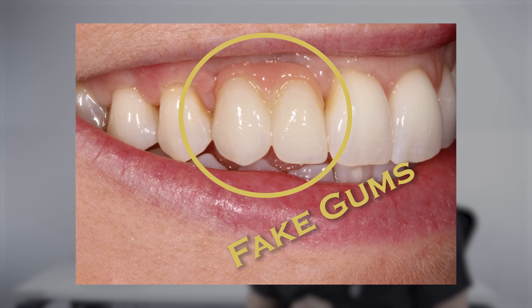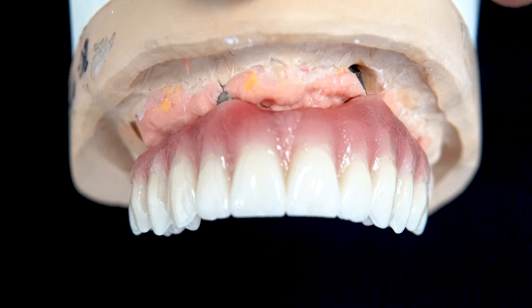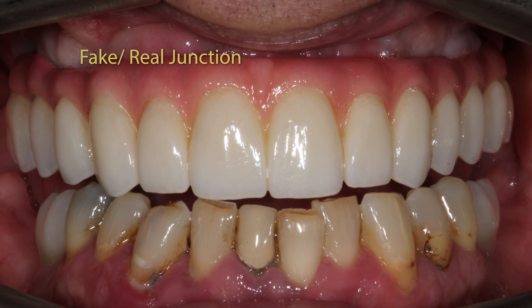Hey everyone, how are we doing? My name's Gus, I'm a cosmetic and implant dentist and today let's talk about fake gum on dental implants. Fake gum is actually something we use a lot when we're doing a full set of dental implants, a full set of teeth on dental implants and stuff like that.